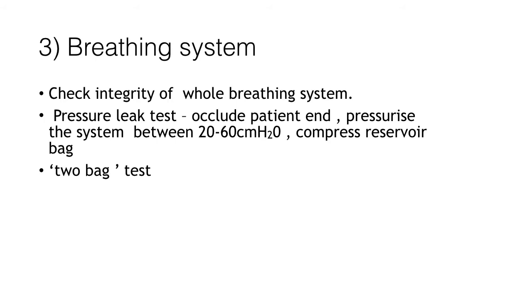Finally, you also need to do the 2-bag test. The 2-bag test is a test that you should do after you've checked the breathing system, the vaporizers, and the ventilator. So I shall talk about this a little bit later once we've discussed the other elements.